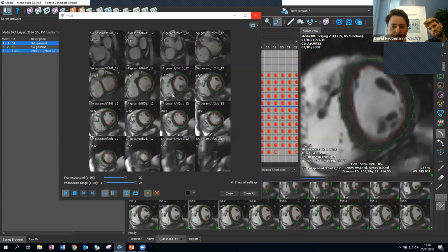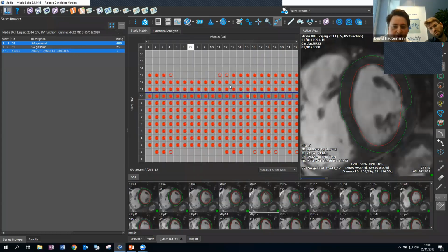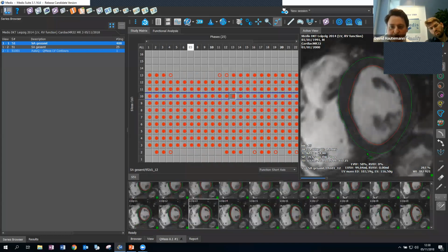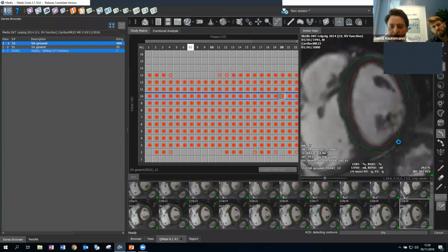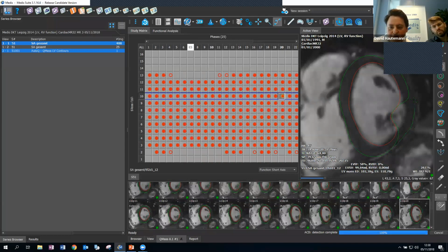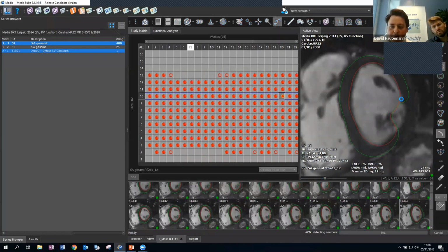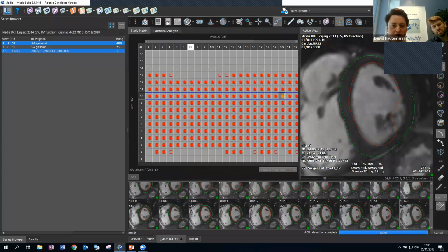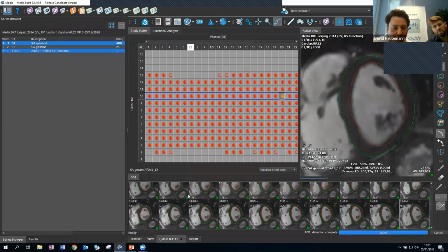Also, when you are going to get this version, we would very much like to hear from you how it works, and yeah, we might be interested to collect some new data in case there's outliers, or for certain cases where the training was not optimal, so that we can see if we can further improve this algorithm. We can continue to learn. I think that's the beauty of the deep learning, that we can add cases.